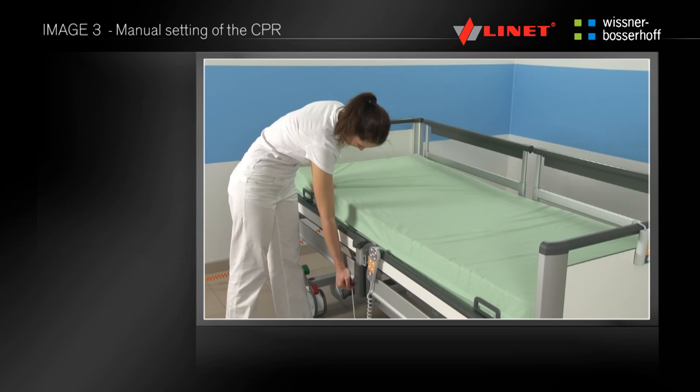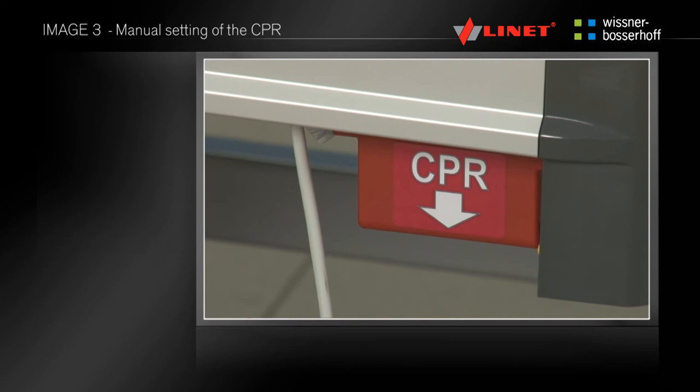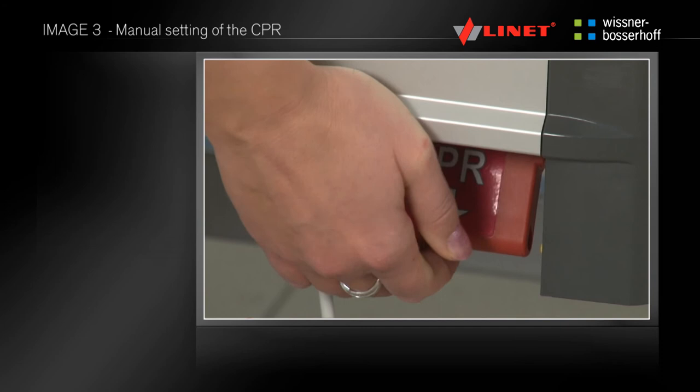The CPR function is used to quickly tilt the positioned backrest. Manual CPR control is located on both sides of the bed in the middle of its length — this is the handle highlighted in red. You unlock CPR by lifting the handle, and you must hold the handle raised throughout tilting.